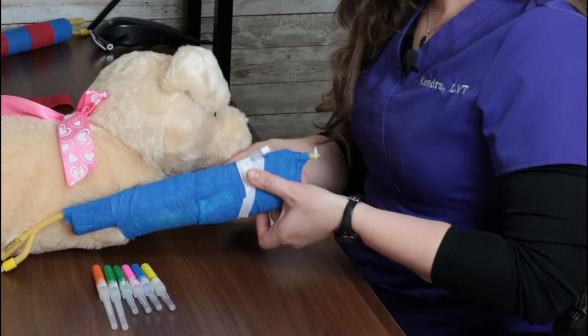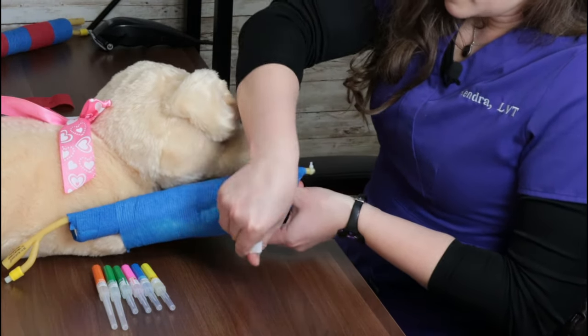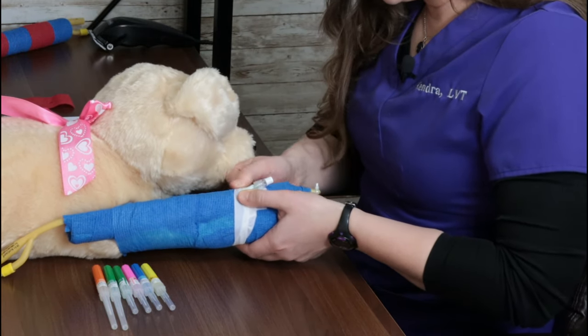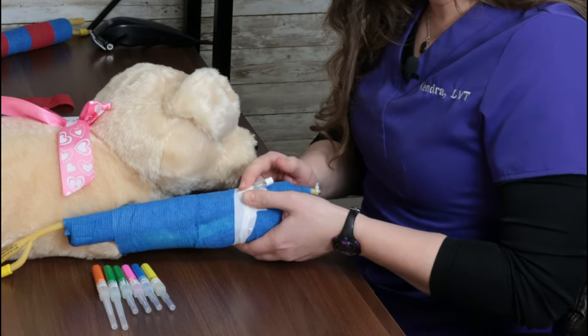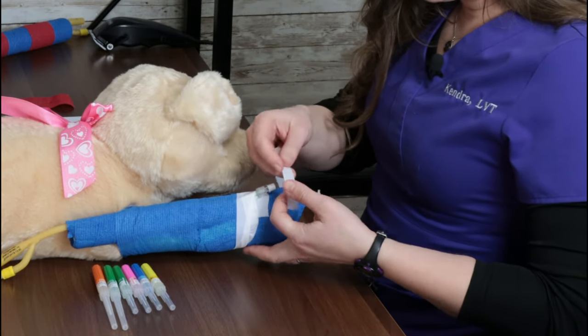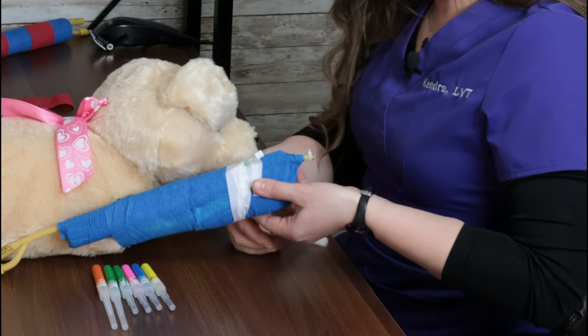Patient Penelope's skin is not the easiest skin to tape, but this will also secure our catheter from the front and the back. Then I use a skinny piece, last skinny piece, and this one secures my cap into place.